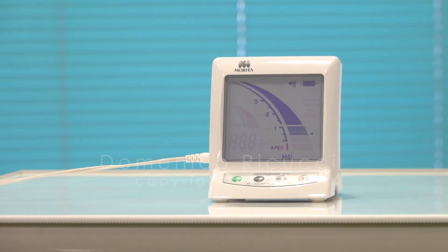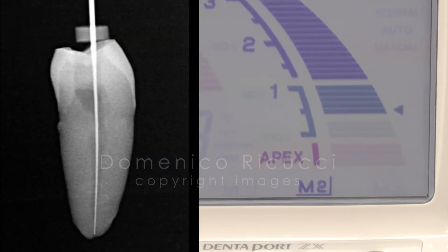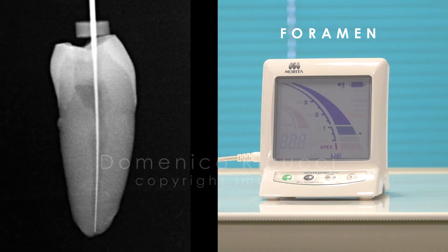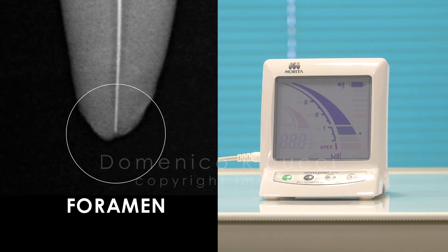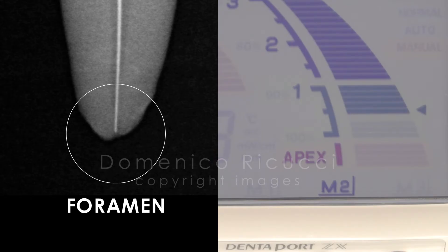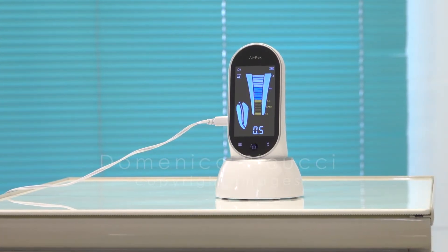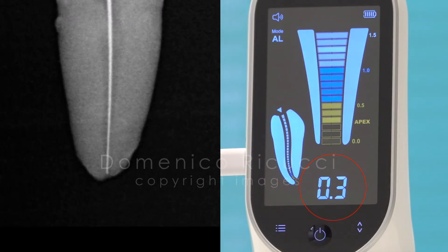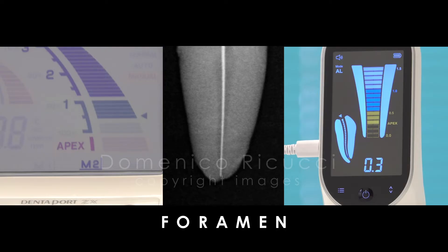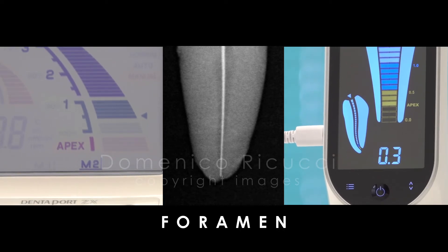The next step was reaching the zero reading point with the Morita device. According to our observations, this point corresponds to the foramen. A radiograph indicates that the tip of the instrument is now closer to the radiographic apex. The file was then inserted at the same depth and the measurement made with the Apex Woodpecker. The device gave the measurement of 0.3. So the zero reading point for the foramen is given by Morita at the middle of the green scale, and at the value of 0.3 by the Woodpecker.